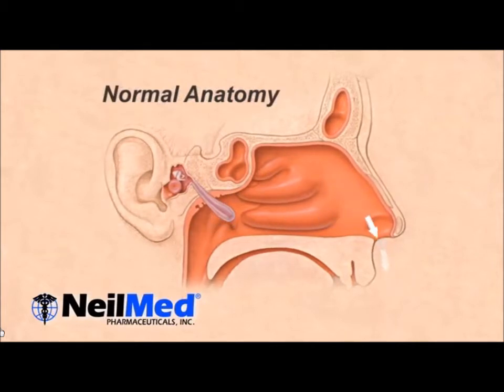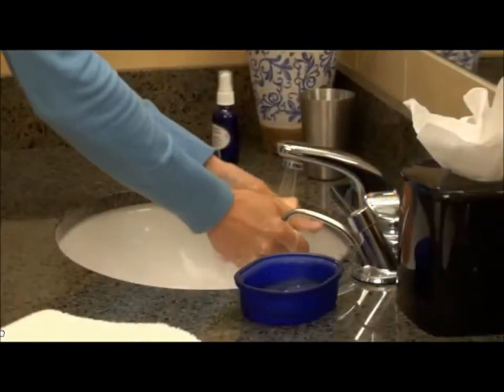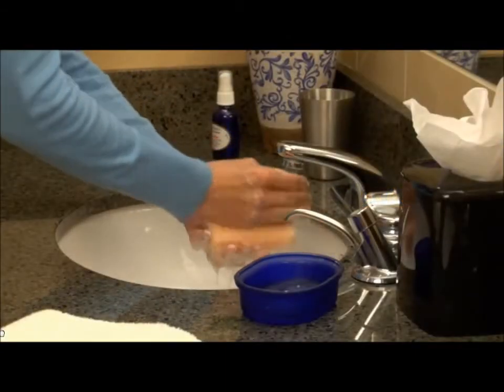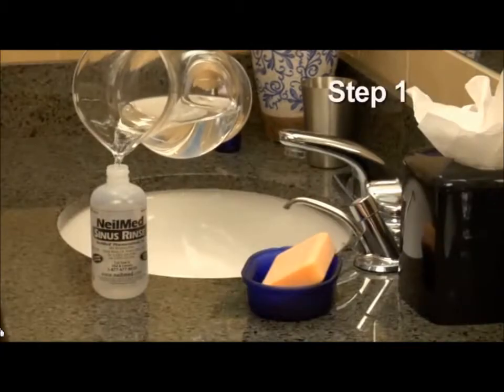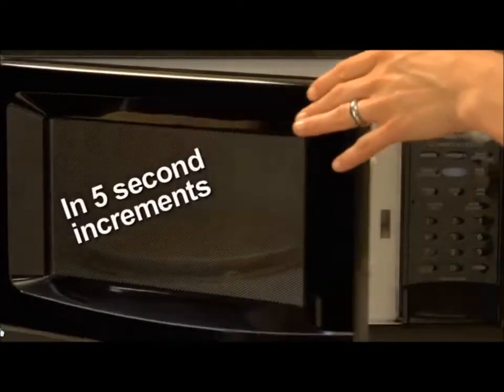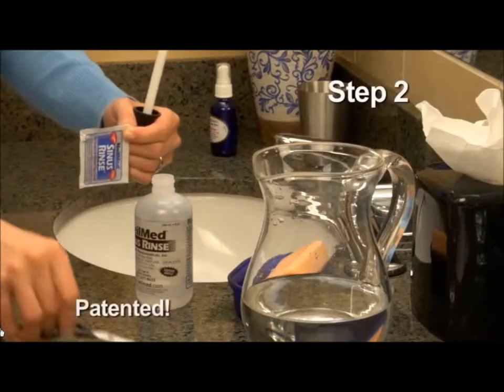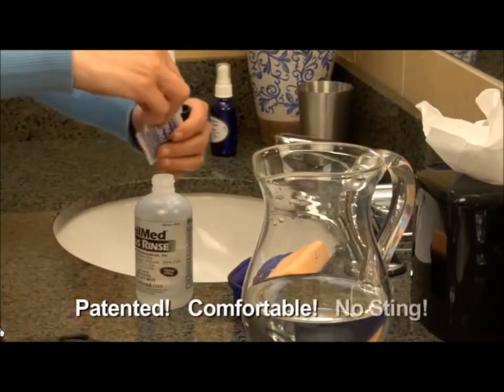It's so simple even a child can do it. Just follow these easy instructions, which will become second nature to you in no time. First, be sure to wash your hands well. Fill the pot with 8 ounces of warm distilled water or previously boiled water. It's okay to warm the water in a microwave, but you don't want the water to get too hot. Next, cut the corner of the sinus rinse mixture packet.